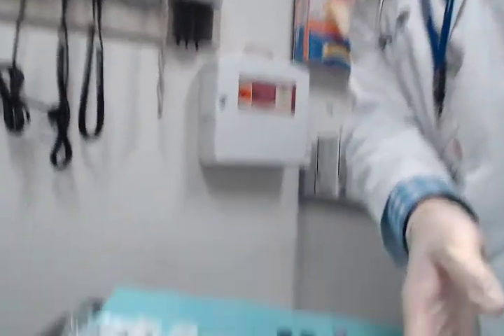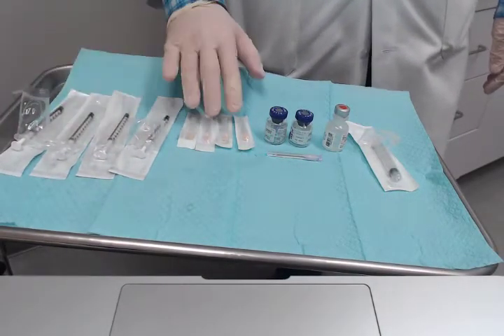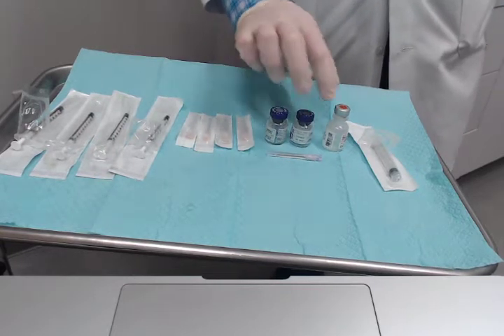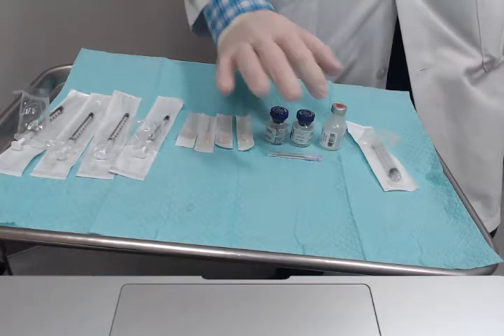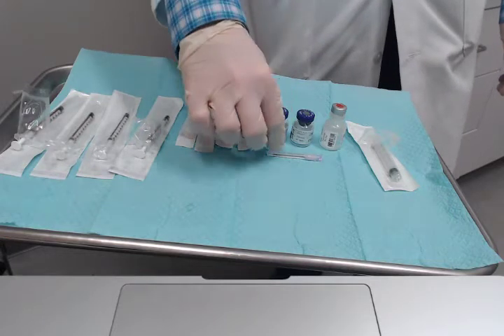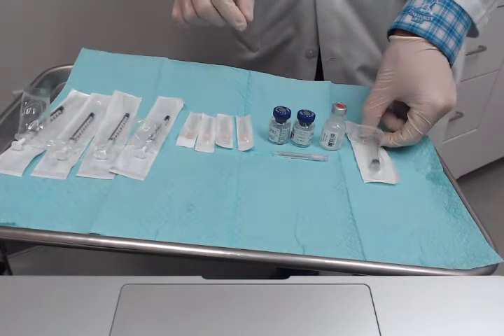I have laid out everything that we use here. It's important to get the right amount of fluid without wasting the Botox. There's a very small amount of material in the bottles, but you want to utilize it all so you don't waste it. What we have here is: four 1cc syringes, four 30-gauge half-inch needles, two vials of Botox, one bottle of normal saline — or I sometimes use 0.25% Marcaine, depending on the patient and how much tenderness they have over the occipital nerves and musculature in the neck and cervicals — an 18-gauge or 22-gauge needle, whatever you have, and a 3cc syringe to draw up the fluid.